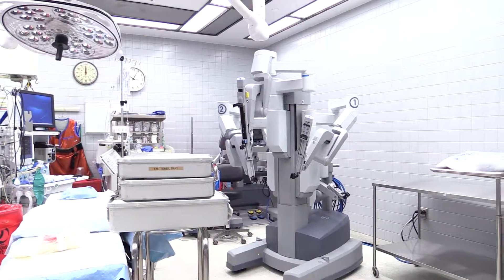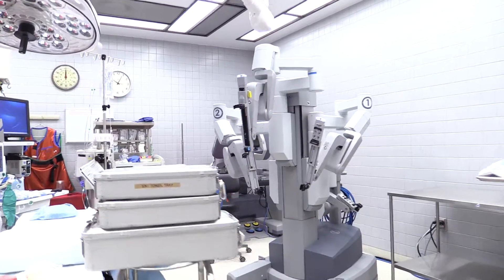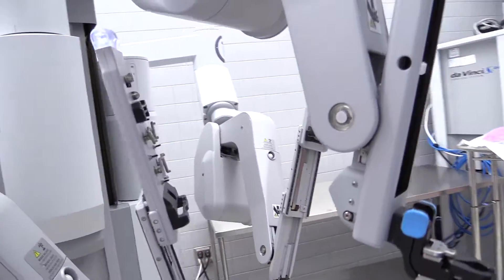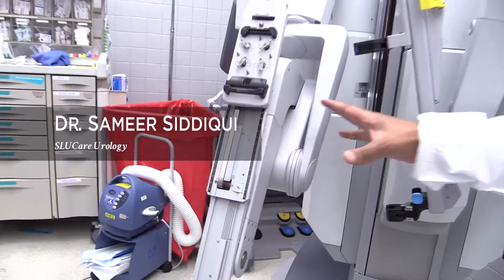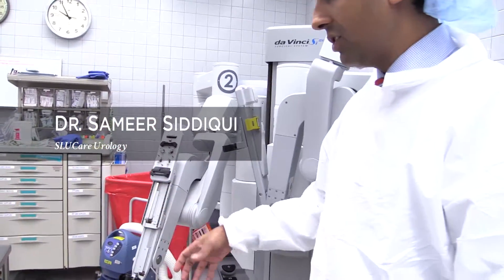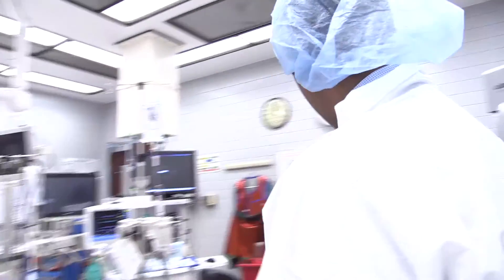So this is our operative room. We've got some equipment here because we're going to have a case later today. This is the actual robot that's attached to the patient. These arms actually go right up to the patient, and we have instruments attached to these that go inside the patient. So this is brought close to the patient — let me just show you how that works.